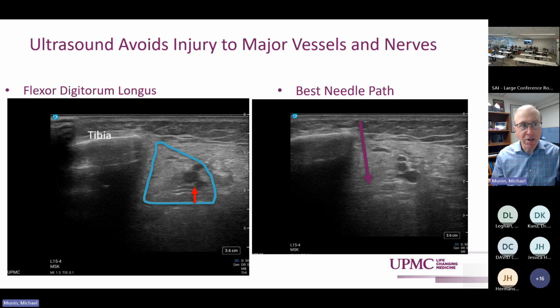And so, assuming that we've done a good job diagnosing what muscles are moving the head in terms of the dystonic posture, we can ensure a very consistent outcome cycle after cycle. And again, that leads to better compliance. So these are some unrecognized gains of why ultrasound guidance, I believe, has a really, really important role in our chemodenervation procedures.